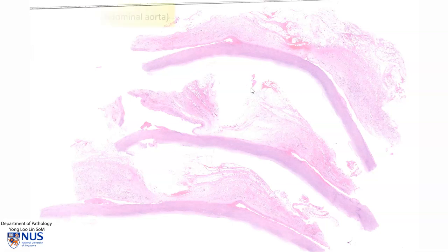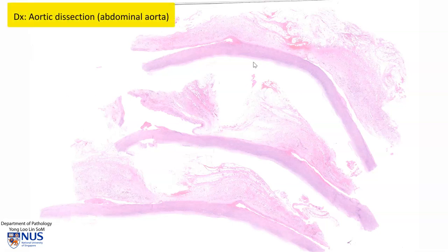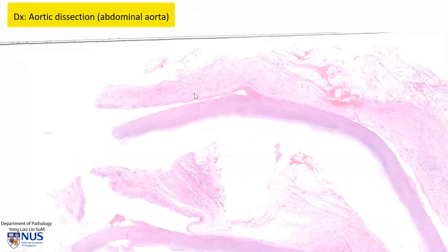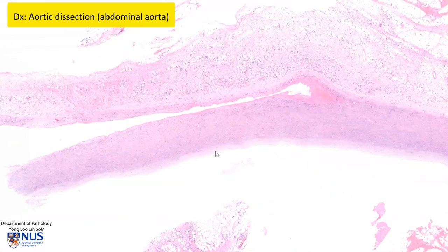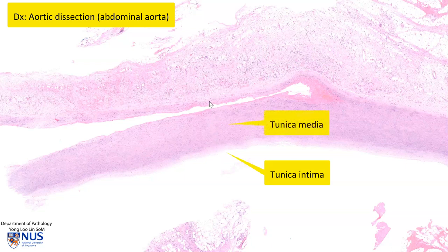Hello, this is a virtual microscopy slide showing three transverse sections from the wall of the abdominal aorta. Let's focus on this one here. To orientate ourselves, this is the tunica intima, this pink layer is the tunica media, and this is the tunica adventitia.